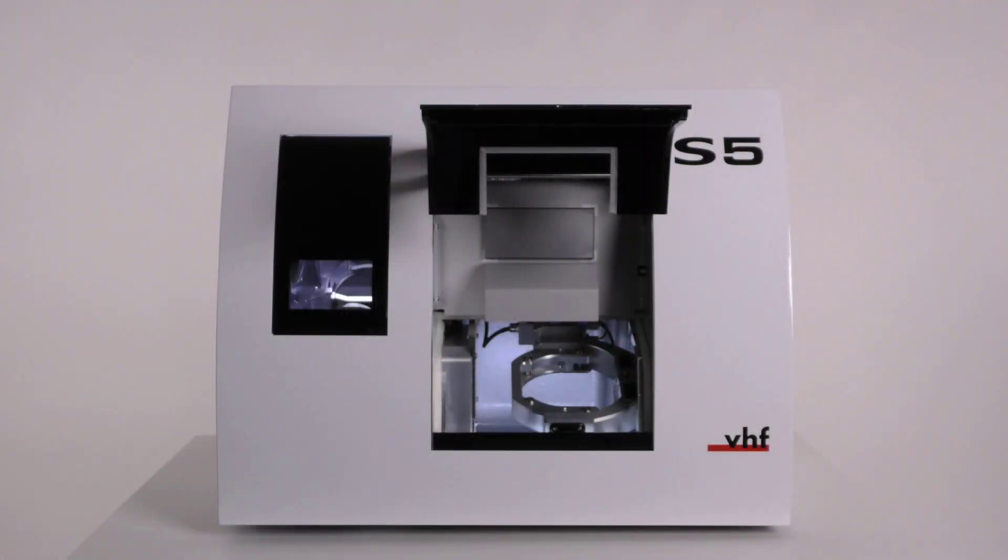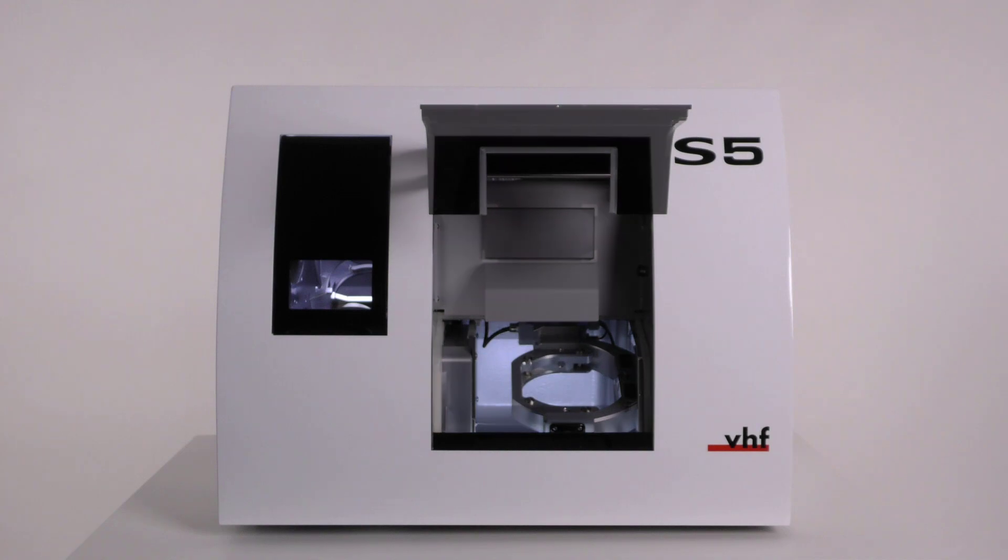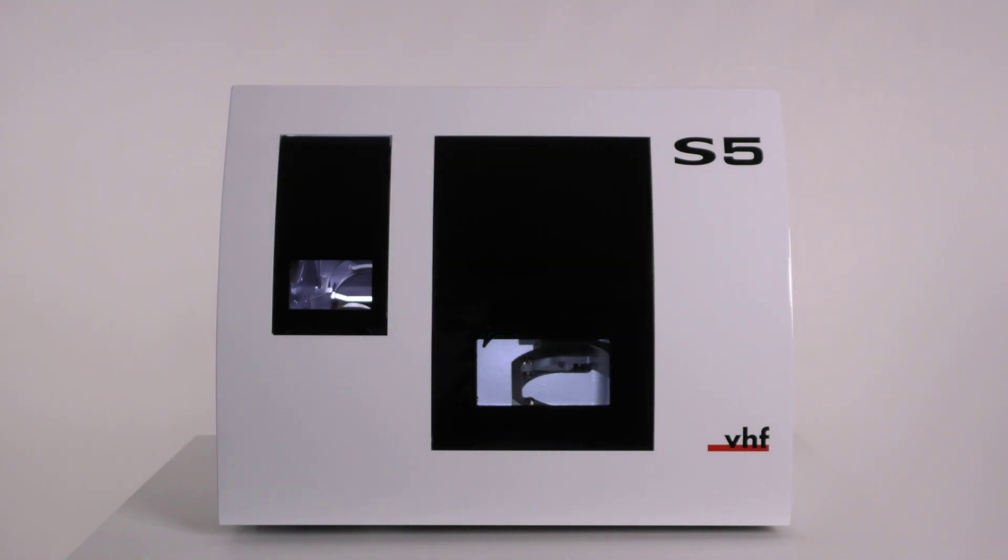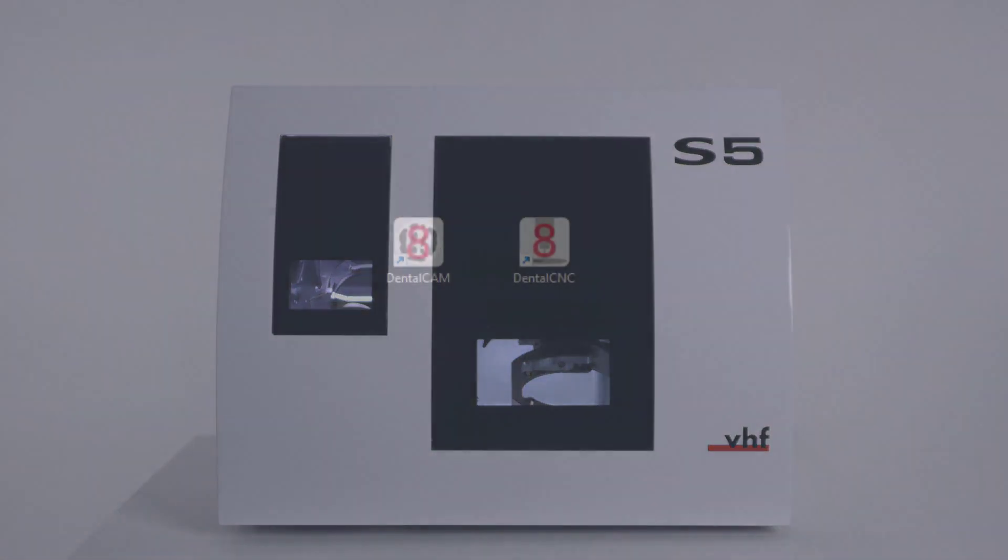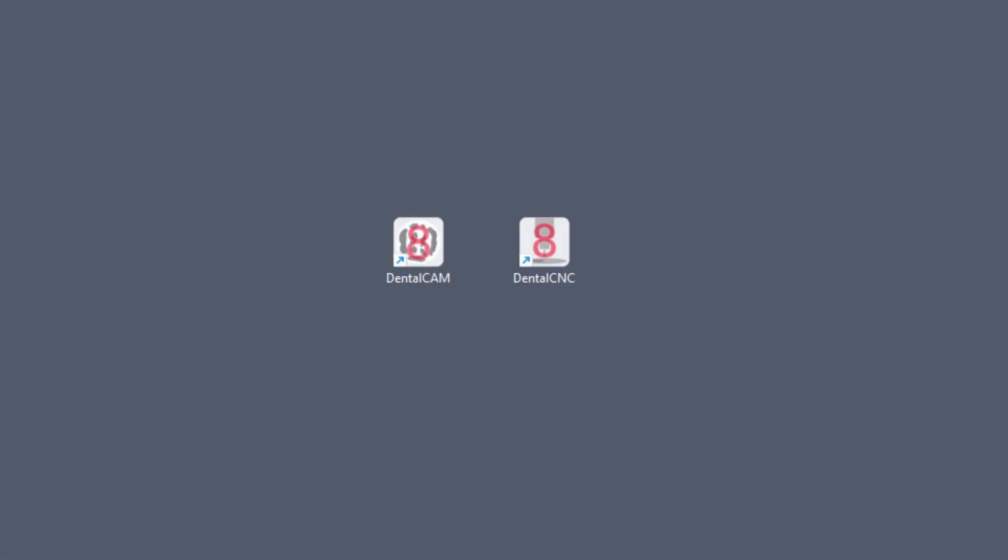If the working chamber door is open, close it. We presuppose that you have already installed the installation package with Dental CAM and Dental CNC on the CAM computer.